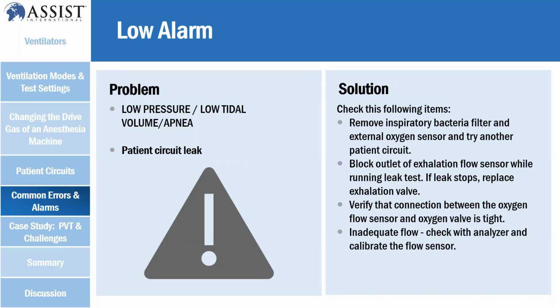But if you're seeing 700, that means something is wrong with the flow. You need to check that particular part. Sometimes it's due to a wet circuit on the flow line, or the flow sensor needs to be calibrated.